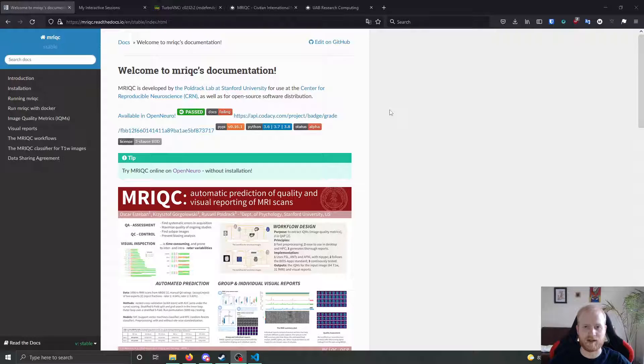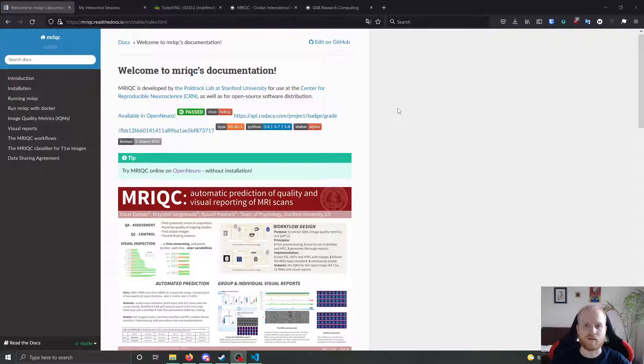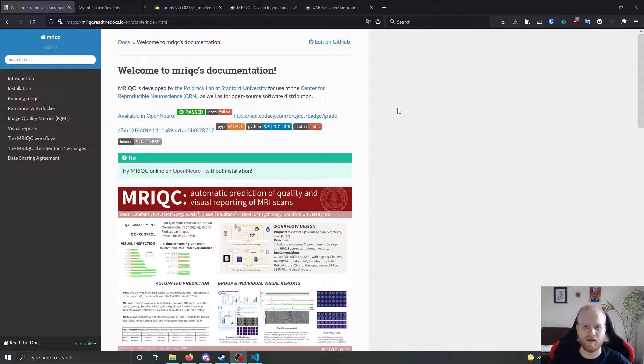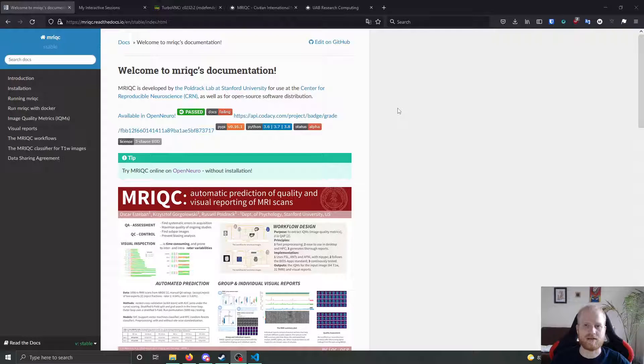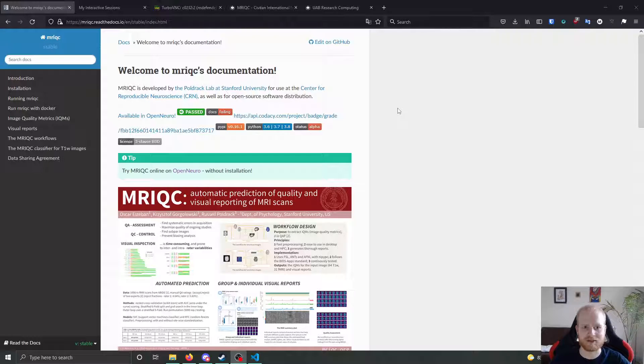And I'll show you how to look at that here in a little bit. But what it does is it takes bids formatted data, and it runs through the unprocessed data, extracts the general information about things like movement, and general noise, and presents them to you in nice HTML file formats. It shows you a bunch of pictures and everything. We'll see that here in a little bit.